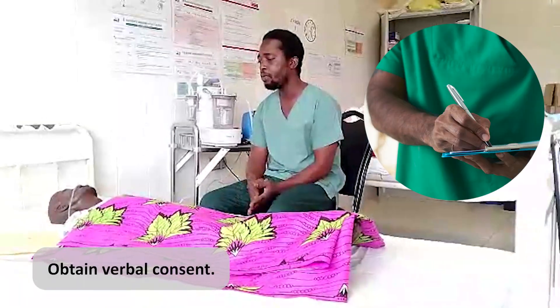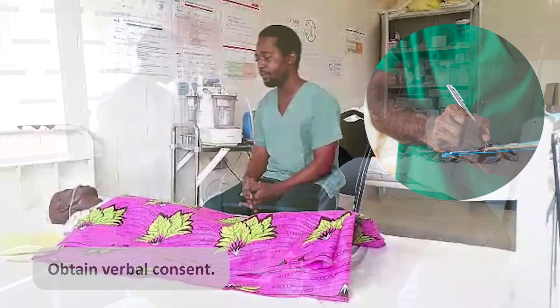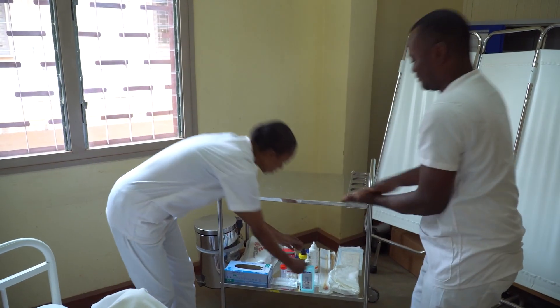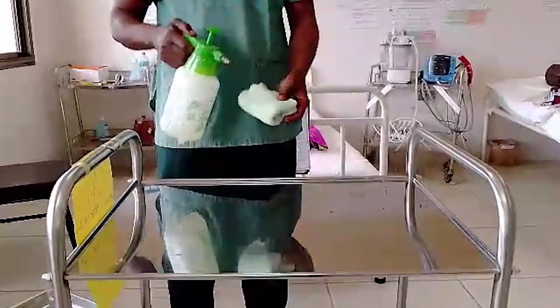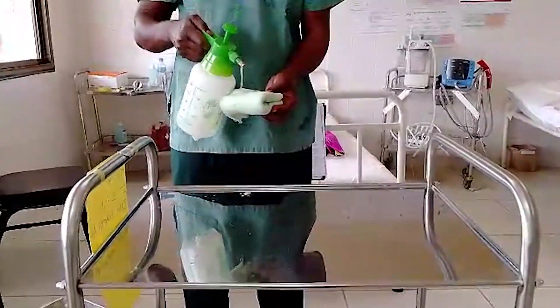Once verbal consent is obtained and documented, we can prepare to move on to our next steps. After leaving the patient's bedside, perform hand hygiene. Clean and disinfect the tray or trolley for the equipment to avoid cross-contamination.